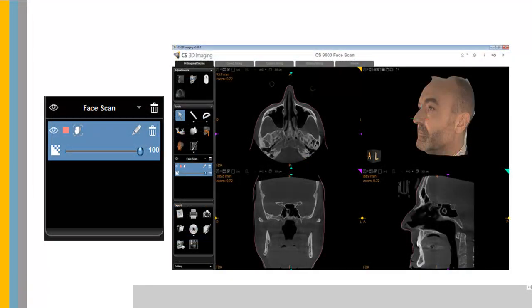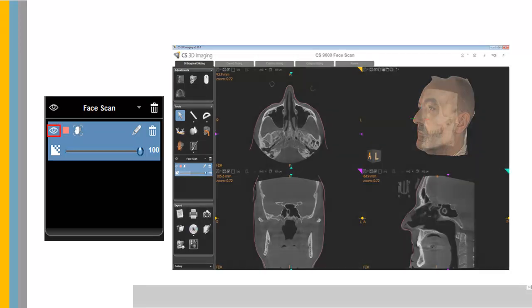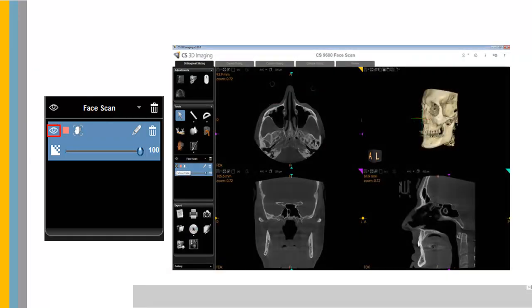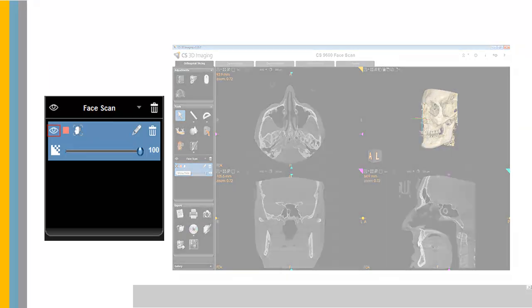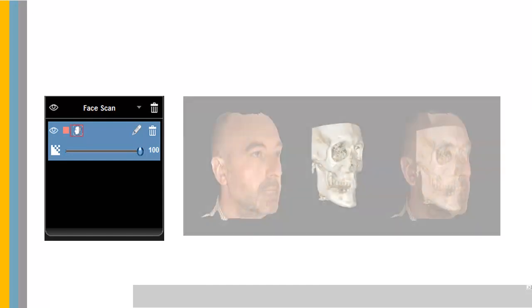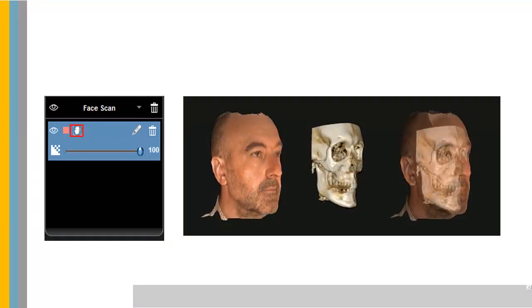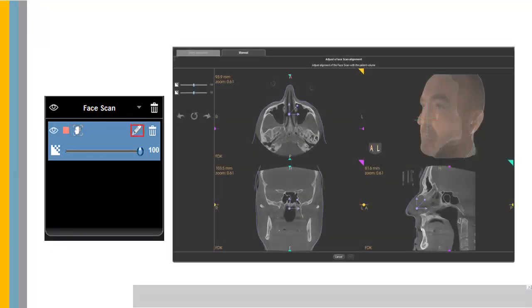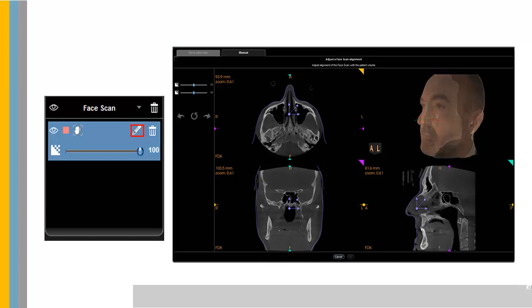The Face Scan Toolbox includes Show or Hide the Scan, Change Skin Line Color on NPR Views, Adjust the Face Scan Transparency, Edit Registration, which allows you to fine-tune the Face Scan Registration, and Delete Face Scan Registration.